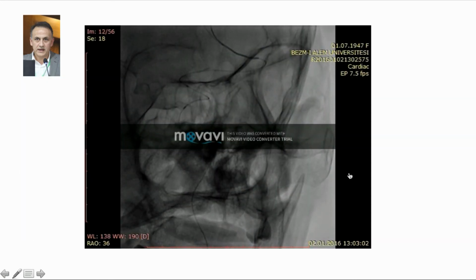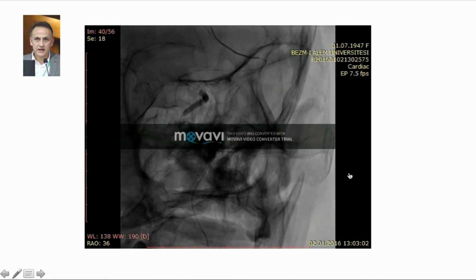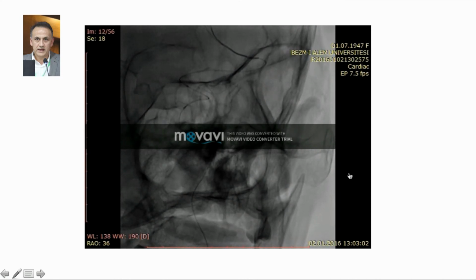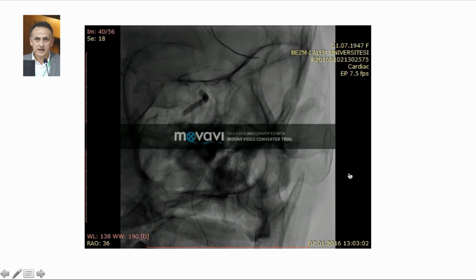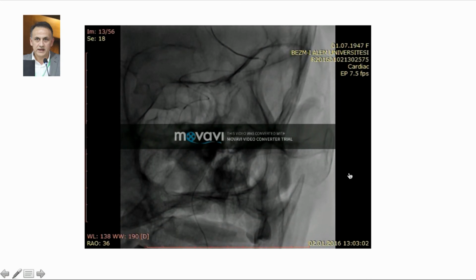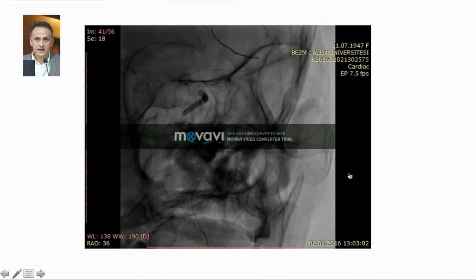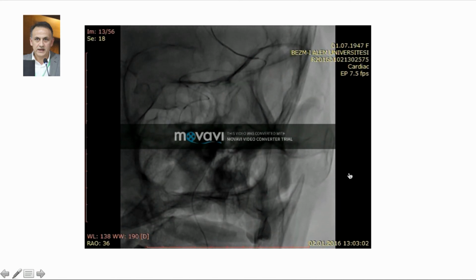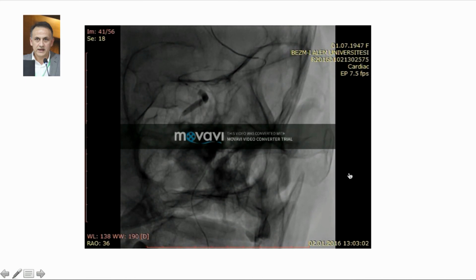I had a case from my colleague. It's not my case actually, and it was done by another center. In this patient, after several embolectomy attempts, they did ballooning, angioplasty, and I think it's a huge balloon for this. I think it's around 3, or maybe 3.5, maybe 3.5.